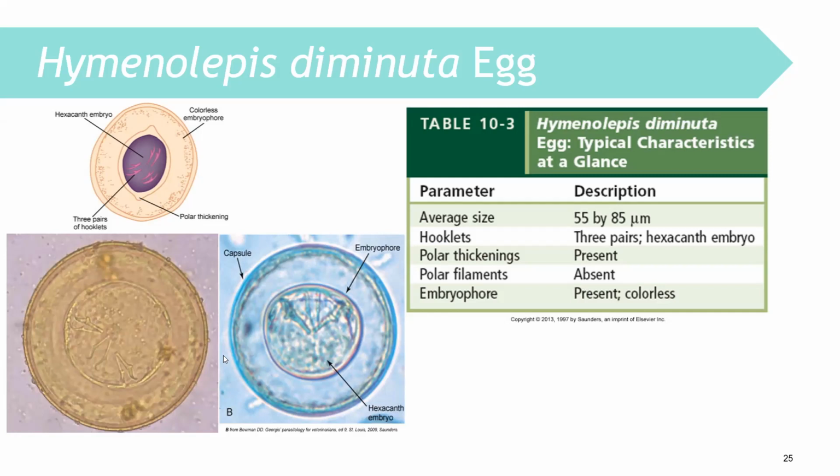Okay. You have to describe the egg of Hymenolepis diminuta. Okay, that was just a commercial. Hymenolepis diminuta. Take note. This is how you are going to describe the egg of Hymenolepis diminuta.